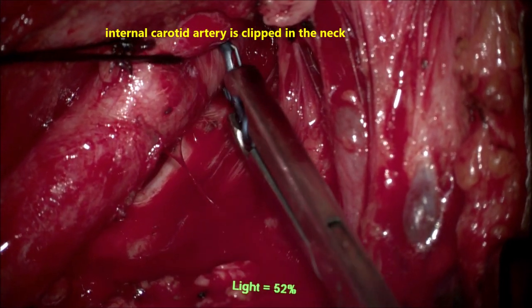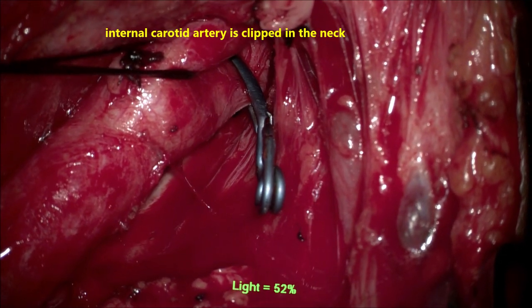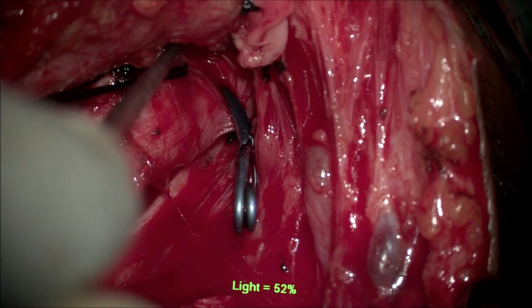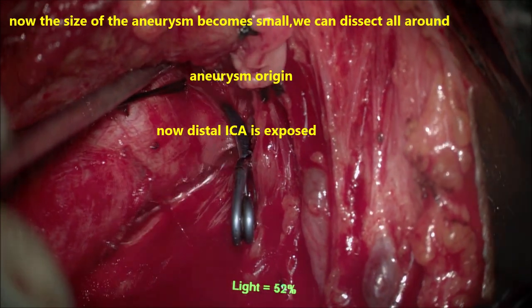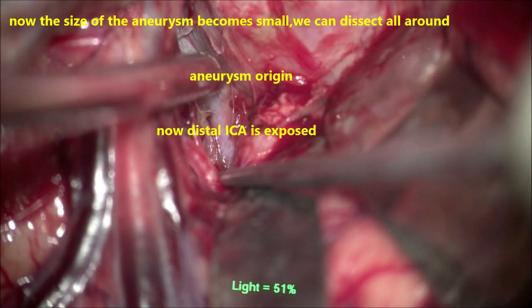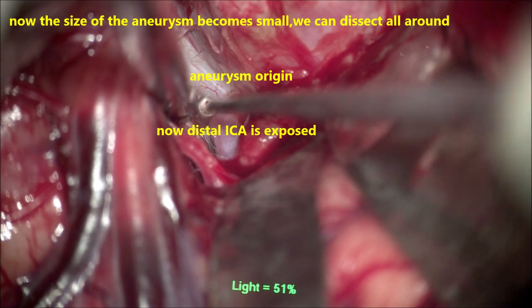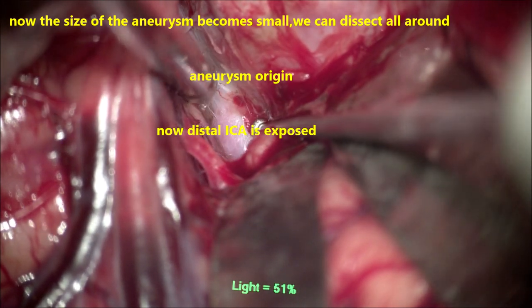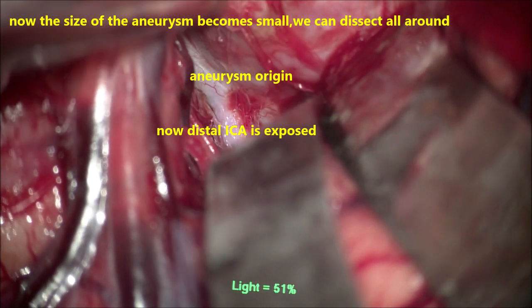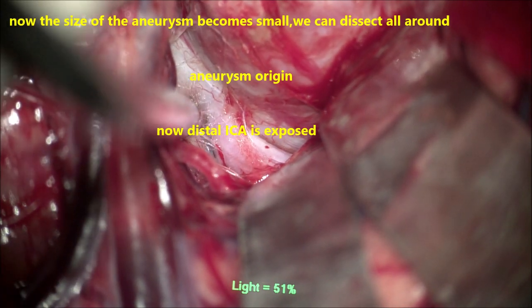At this stage we decide to place a clip on the internal carotid artery in the neck, which has already been exposed and kept ready. The completeness of clipping of the internal carotid artery in the neck is confirmed, and then we move to the cranial end. Once the clip is placed on the ICA in the neck, blood flow into the aneurysm stops completely and the aneurysm becomes smaller in size. However, it is still receiving blood supply from the opposite side through the anterior communicating artery and anterior cerebral artery.